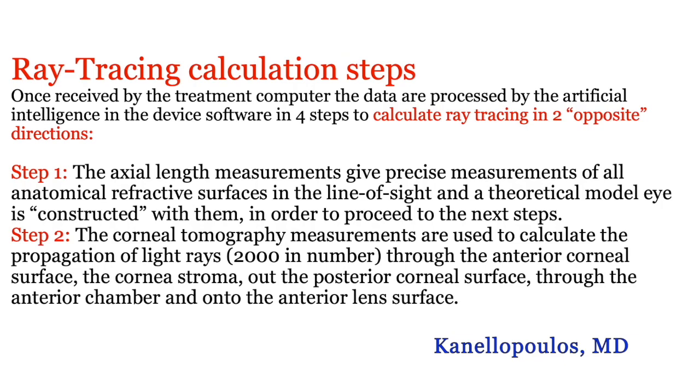we thought that this technology could have application in treating irregular eyes as well. And in essence, just to familiarize you briefly, in this last minute that I have, ray tracing uses 4 steps. It first measures through a single device, the iTrace device in Alcon language, and I do consult for Alcon.